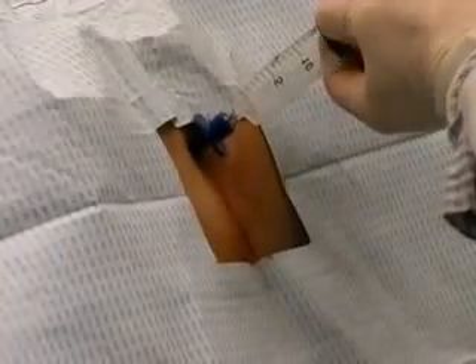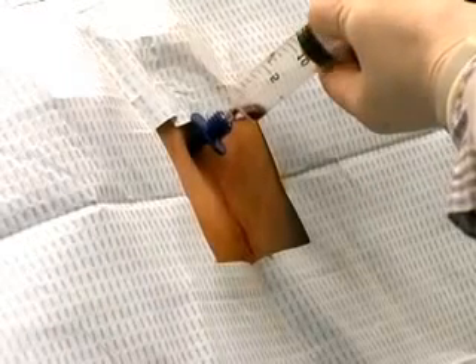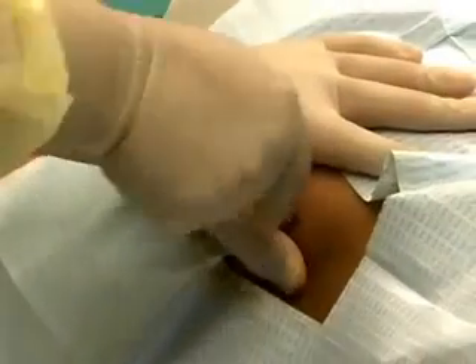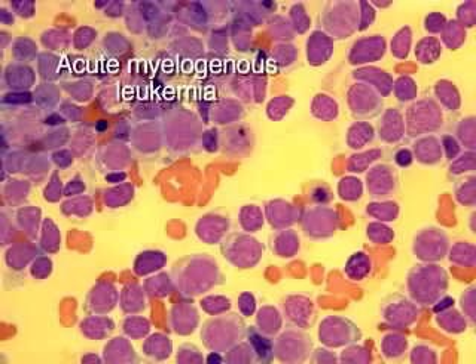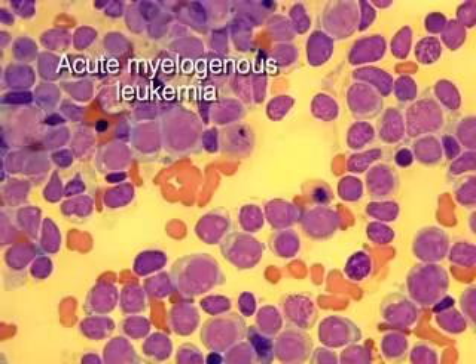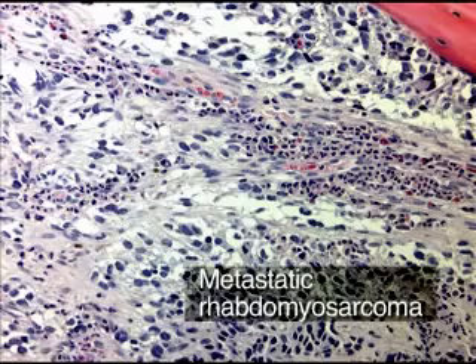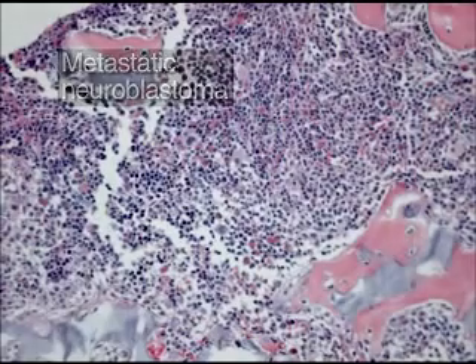This video will demonstrate the procedure for bone marrow aspiration and bone marrow biopsy from the posterior iliac crest. Obtaining a bone marrow aspirate and core biopsy is often necessary when evaluating a patient who has a hematologic abnormality. Examining bone marrow is also useful in the diagnosis of metastatic spread of non-hematologic malignancies and to diagnose metabolic disorders.